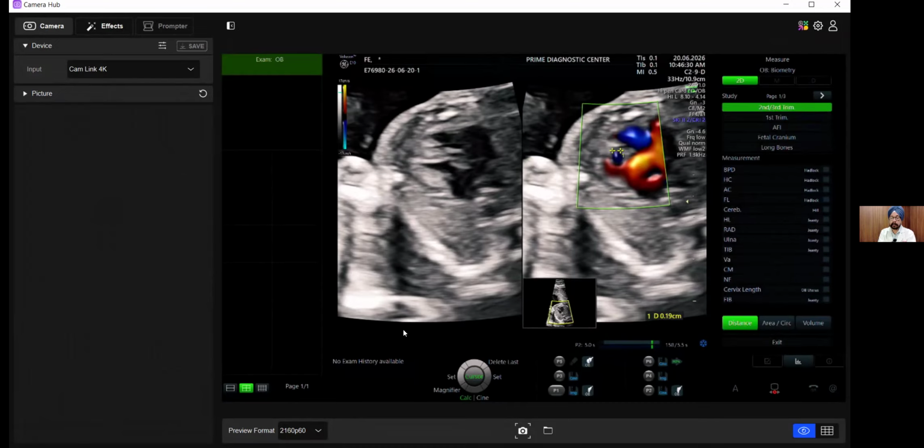Another thing about hunting for VSD: it is just for muscular VSDs. For inlet VSDs, you don't need to hunt. Actually, it would announce itself by a dropout. You don't have to hunt for that, because generally inlet VSDs are rare, and generally they are large.